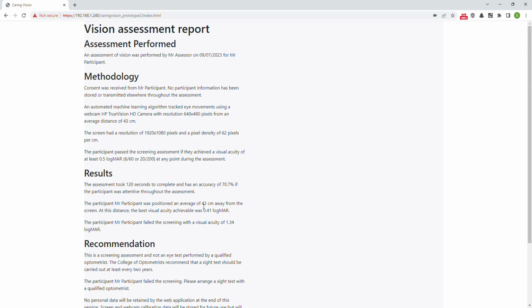It comes up with a recommendation, as you can see there. The recommendation is that I failed the screening and I should have my eyes tested. And of course, it's done that because the current algorithm for the assessment needs to be improved, because clearly the end point is fairly arbitrary and needs to be a lot more well defined than it is at the moment. In addition, future prototypes will take on board the accuracy of the calibration assessment. So if the calibration took a long time and wasn't particularly straightforward, the assumption is that the assessment will also be likewise more challenging and more difficult as well.